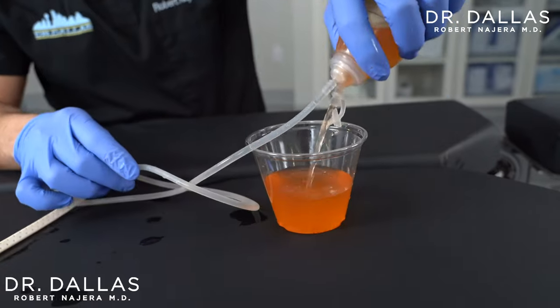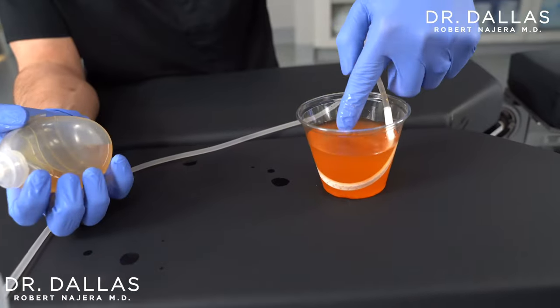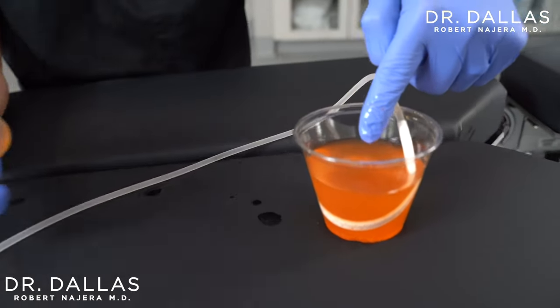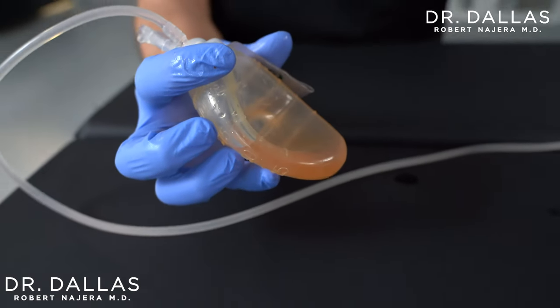The first day or two it's going to fill up pretty quickly and you simply empty it. However, if it stops suddenly — usually in the first three days or so — then we ask people to strip the drain. What does that mean? You're looking at the drain and throughout the tubing there may be a clot that you can see, with it empty behind it.